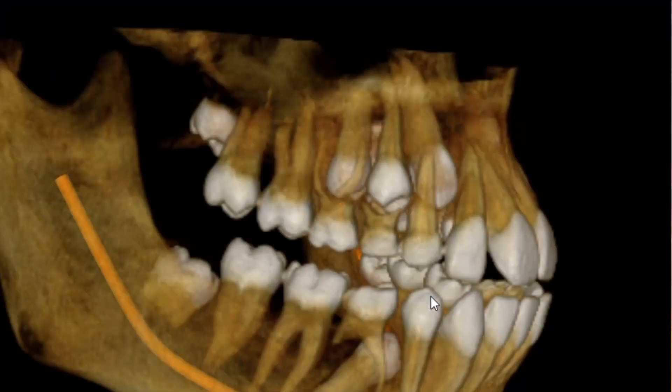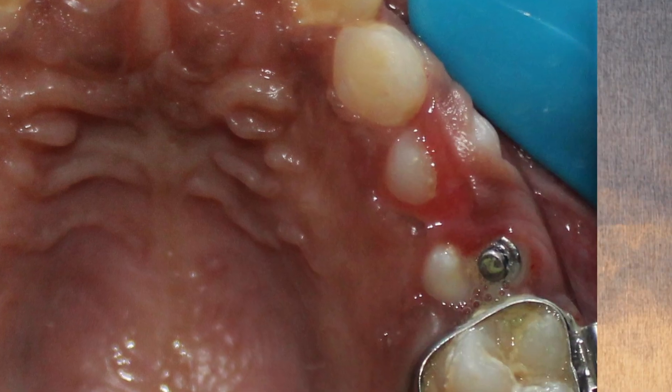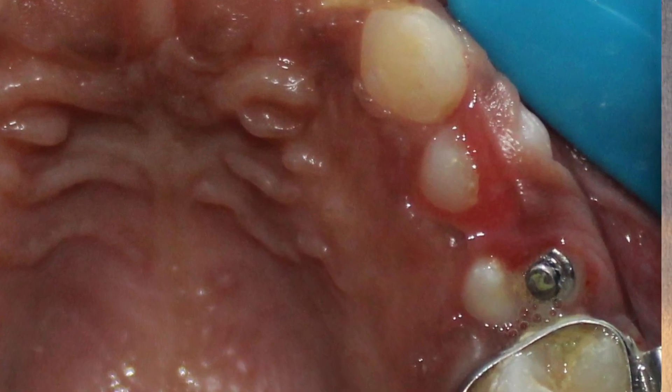I planned to bring all the impacted teeth into occlusion with minimal time and effort. I started with the teeth nearest to the occlusal plane — in the first quadrant, the two premolars. I extracted the deciduous teeth and could see the tips of the two impacted premolars. Two lingual buttons were placed on them, an e-chain was placed, and a single helix spring was placed on the second premolar. Within a month, both premolars had mostly erupted into the occlusal plane. I placed a .016 arch wire and used e-chain over the arch wire — no elastics — to bring them into occlusion.